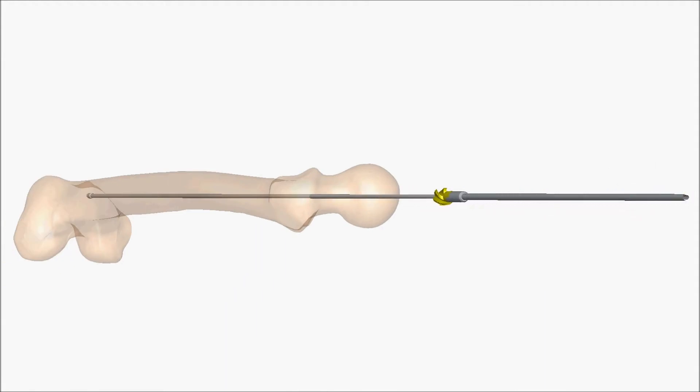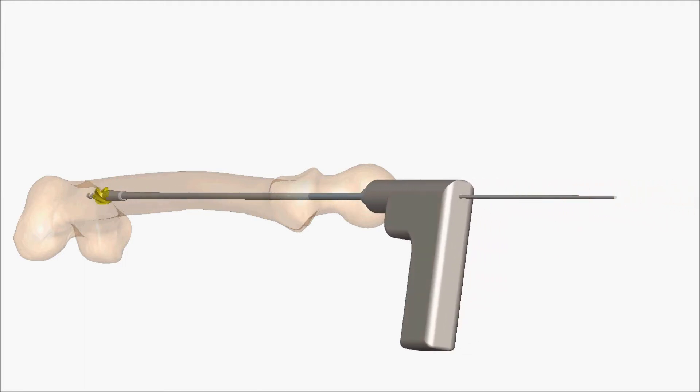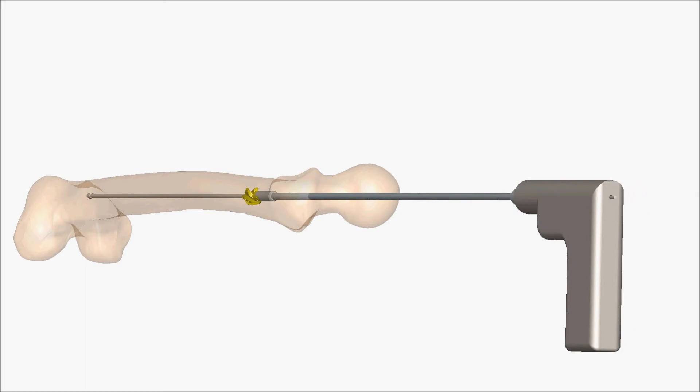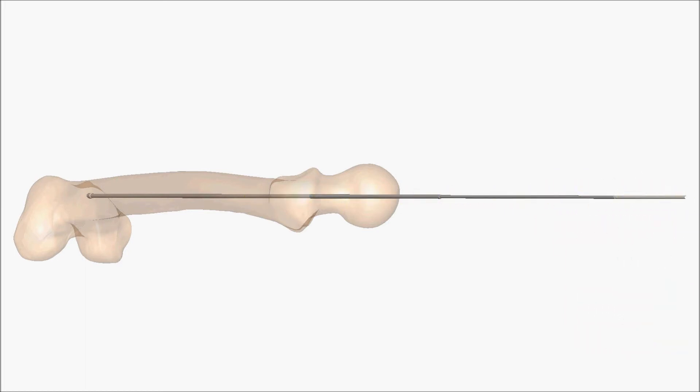If necessary, enlarge the IM canal through sequential reaming. It is recommended that the canal be reamed 1mm greater than the distal diameter of the nail, which is 11mm. Once reaming is complete, remove the outer sheath of the guide wire in preparation for nail insertion.